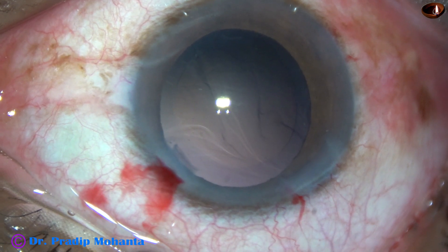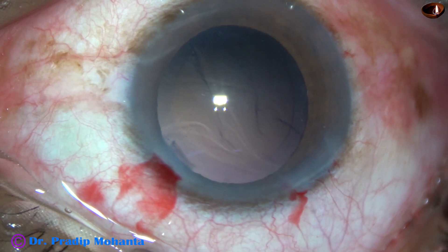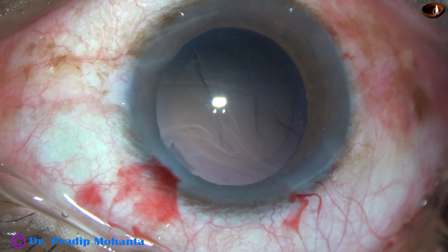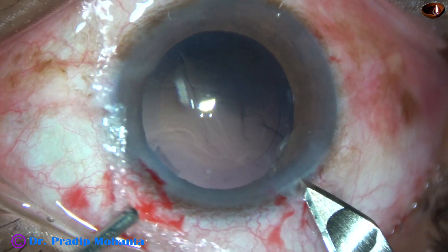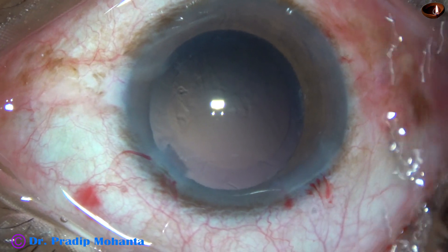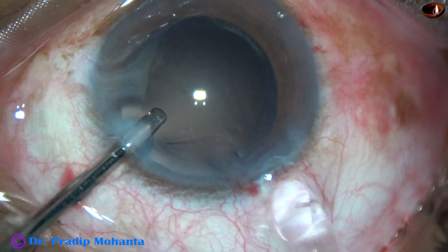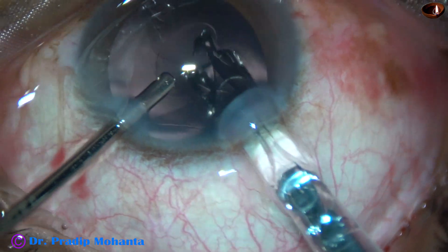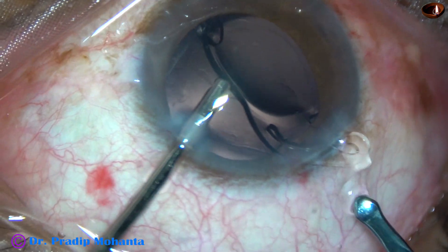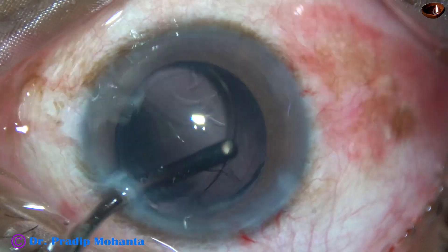And now is the time to implant an intraocular lens. I'm going to use a big cartridge for implanting the intraocular lens, so I enlarge the main wound a bit. And then here goes the intraocular lens into the capsular bag — the leading haptic as well as the trailing haptic goes into the capsular bag.